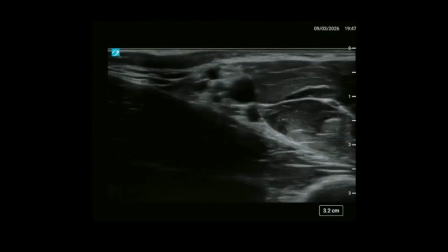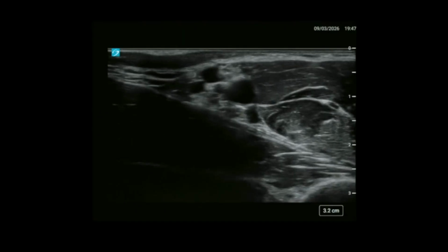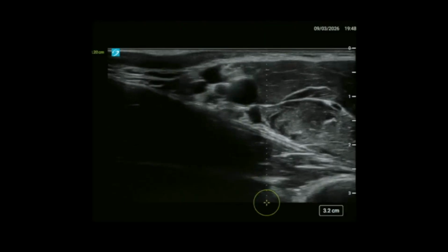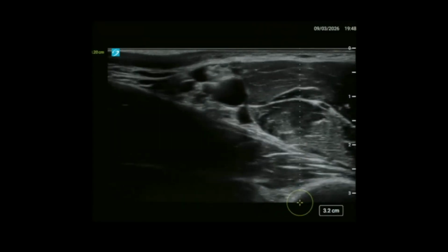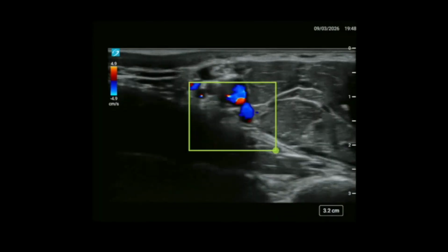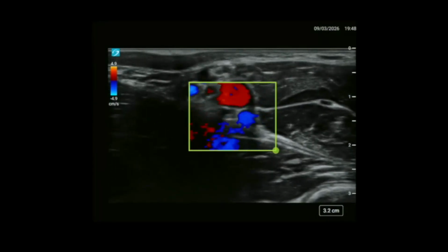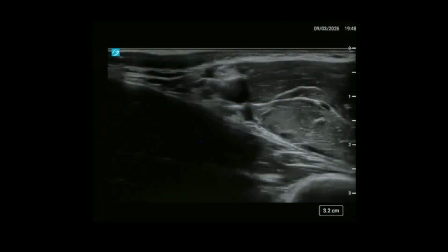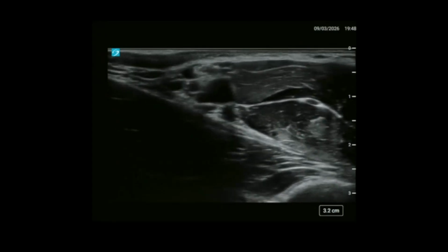And then just underneath the artery in sort of the 6 to 7 o'clock position, there is a hyperechoic structure sat on top of the conjoint tendon, and that's the radial nerve. You can see to the right of it, there is a sort of black hypoechoic structure, which if we put the Doppler on, you can see is a vascular structure. So we would need to be very careful not to accidentally harpoon that on our way in towards the radial nerve. How would you sort of access the radial nerve?